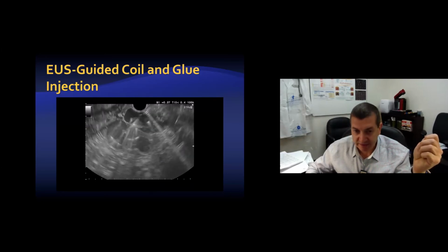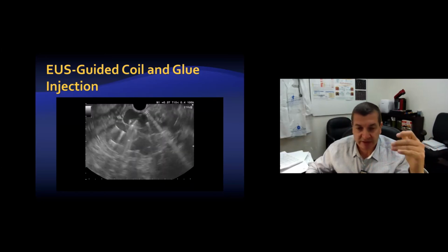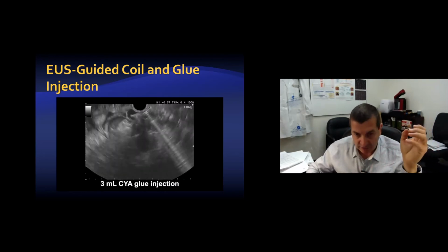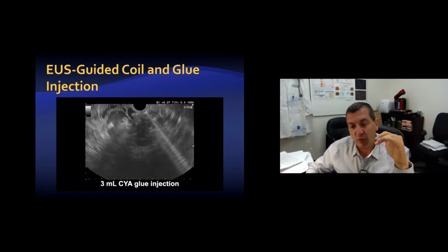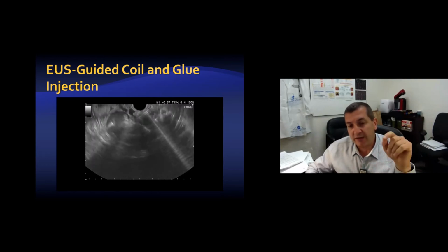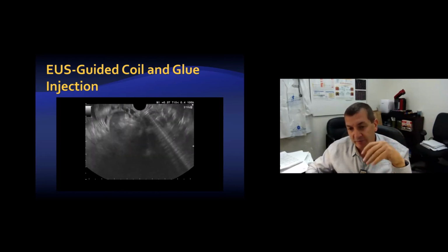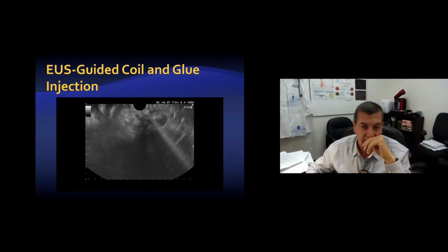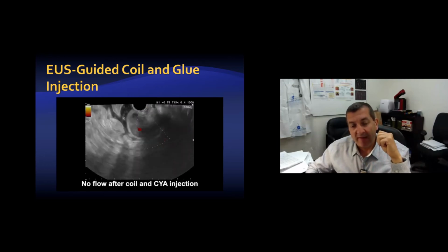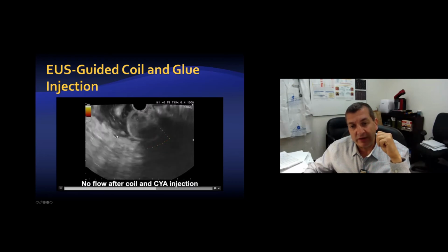Again, obviously, this is a risky procedure because if the patient starts to move, you have to do those cases under general anesthesia, because you can't allow the needle to move. Once you puncture that vessel, you cannot just let go without finishing the treatment of that varix. Otherwise, you will end up with a major bleed. And this is after the glue injection.